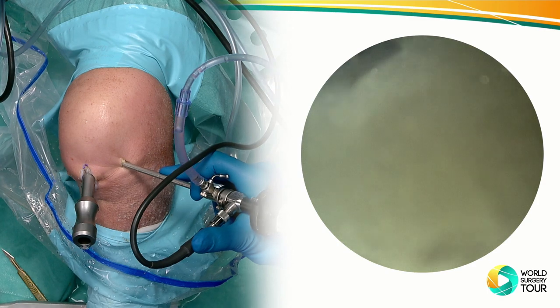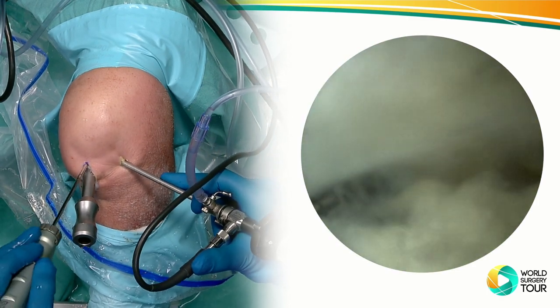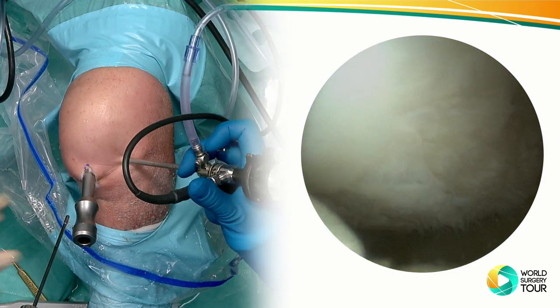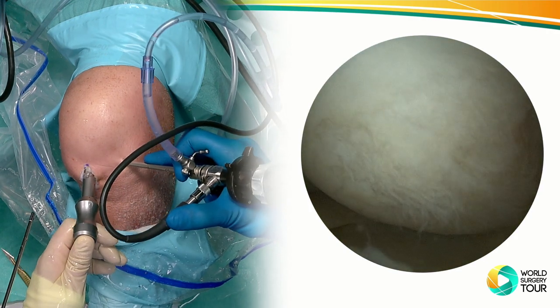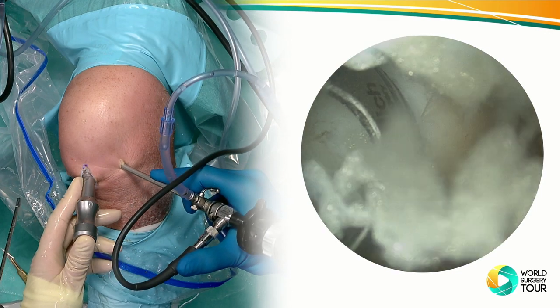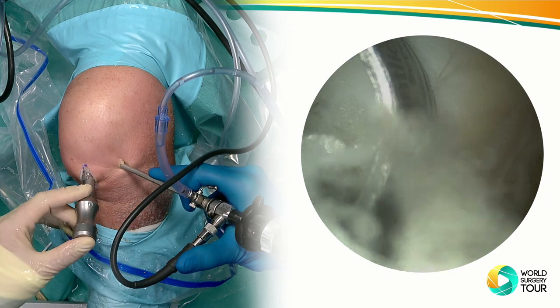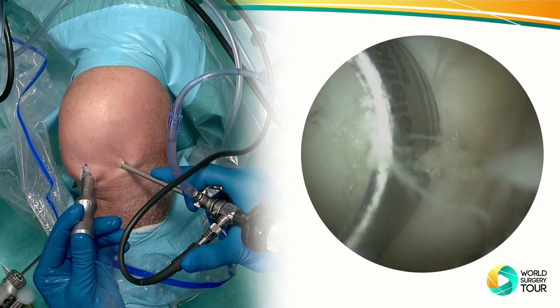So we're going to get a little more vision there. How can you avoid losing so much water? Yeah, it's a good idea. Your finger. Thank you. Let's see that we see this again. The window is good. You can still go a little deeper. Okay, with a punch. Can you also bang it over the trocar?